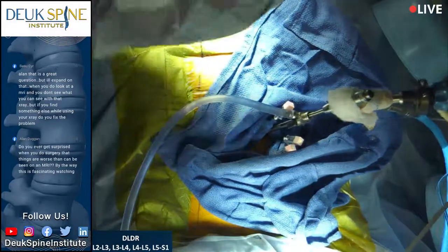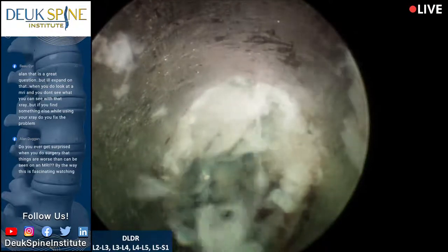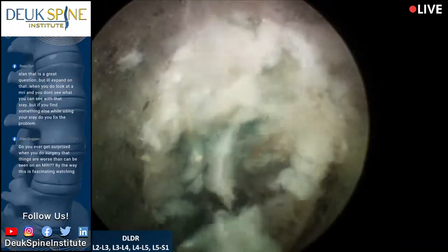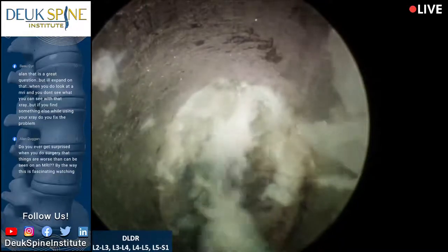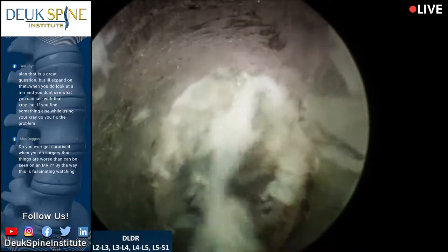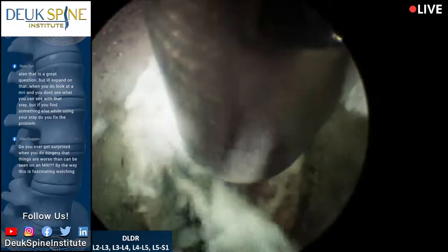So let's take a look at what we're seeing here, folks. This is beautiful. We are inside the tear at L4-5 on the left side. And what I'm seeing is the annular tear right there at 12 o'clock. Let's turn the lighting down one click on brightness, one click. I want you all to see this tear right here. Yeah, there it is, thank you.